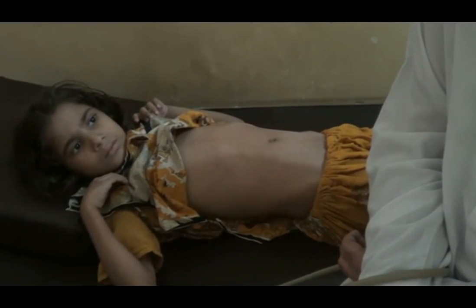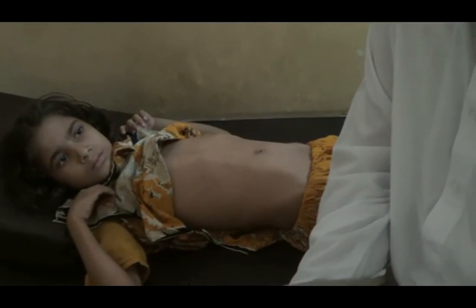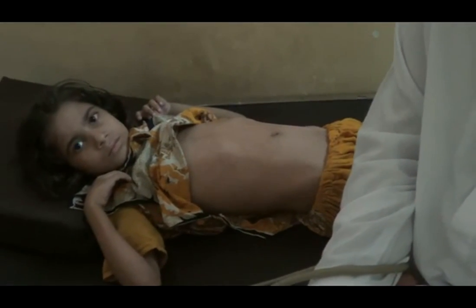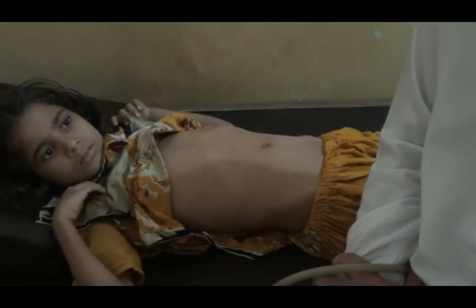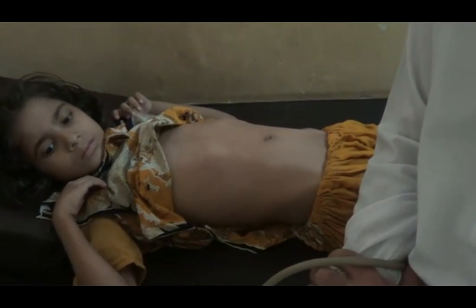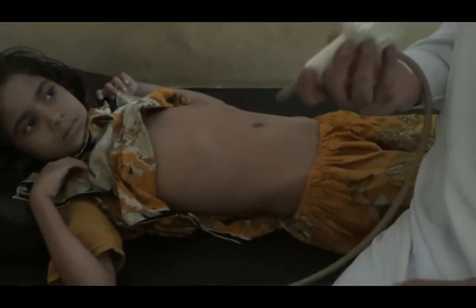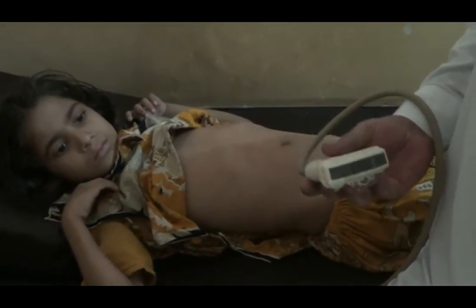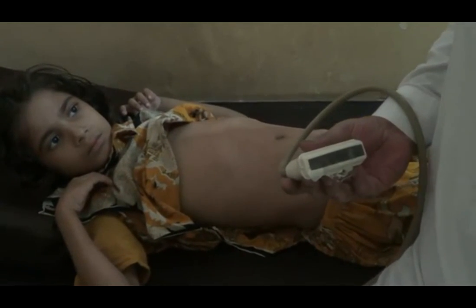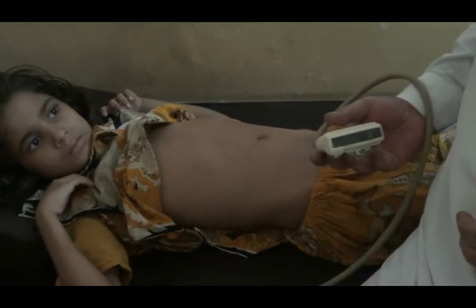I have a 10-year-old girl who has been referred with the complaint of PUO for the last 3 months, and she has been taking medicines for the last 3 months. This is the first ultrasound that she has been referred for, to rule out any pathology if we can by ultrasound. No clinical or laboratory investigative procedures have been provided.